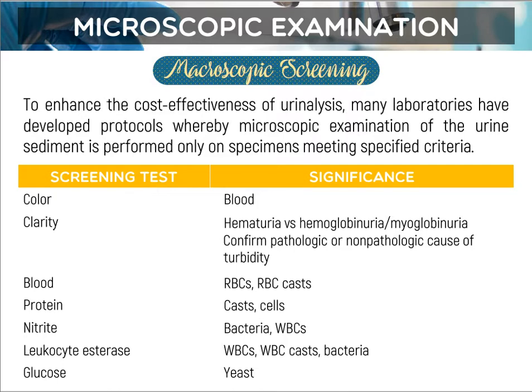Alright, so labi na sa mga hospitals or labs na wala kayo gamit or short on equipment, dili sila usually nag-microscopic exam unless ma-meet nila ni na mga criteria. Alright, pwede pod sa uban na baling daghana kaayo na patient sa usa ka hospital, dili na makater tanan na i-microscopic, so pilian lang jud, okay?